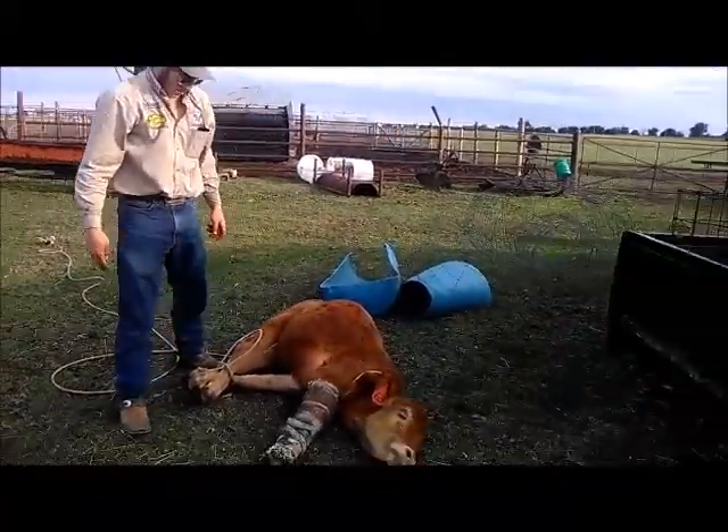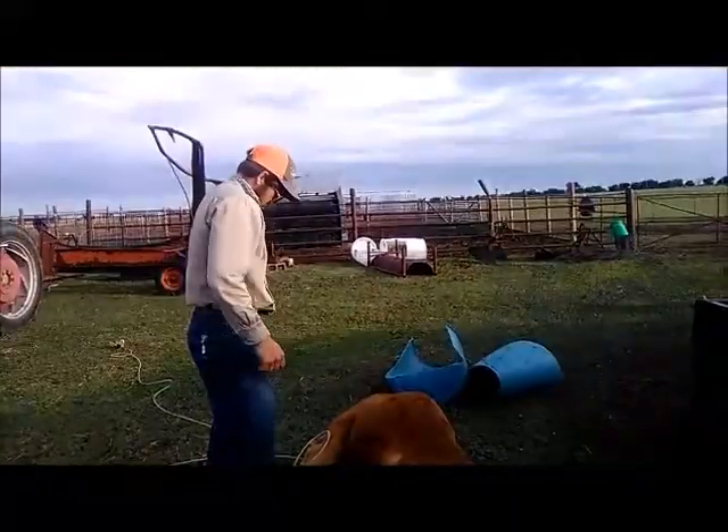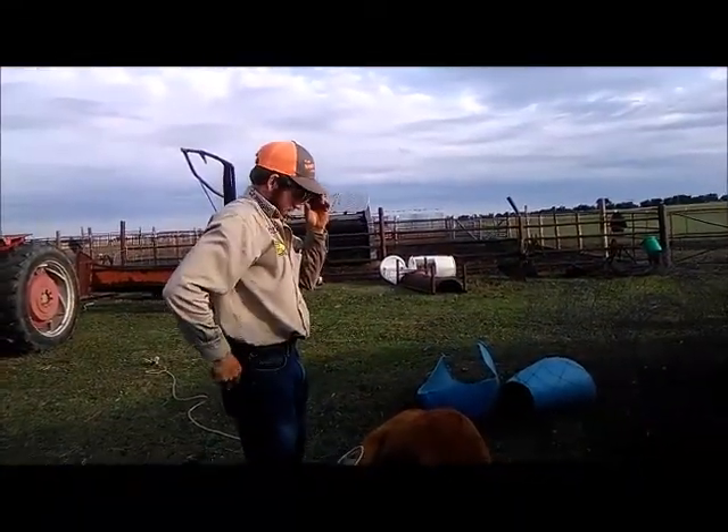All right, RJ, what are you doing? We're going to remove this cast that's on her plug. Okay, and how do you plan on doing that? I've got a sharp knife.